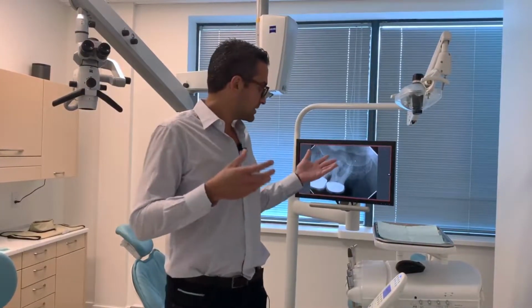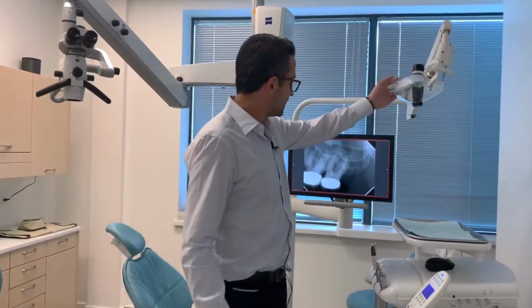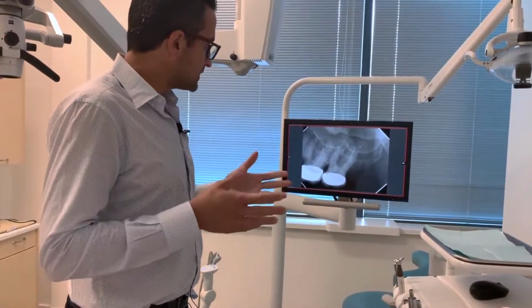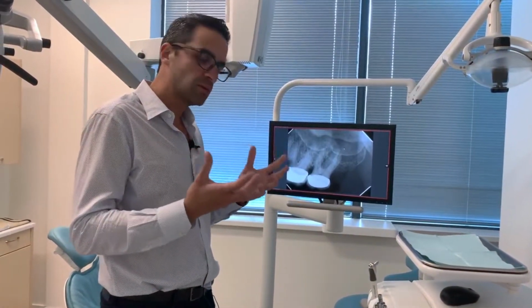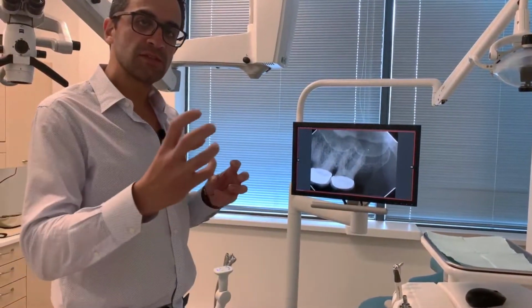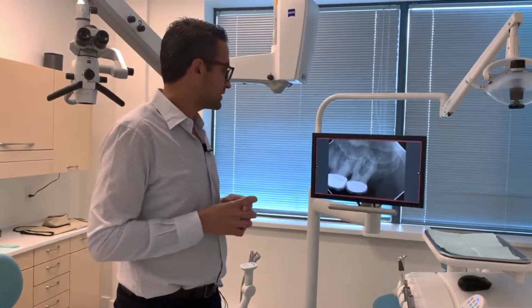And I took an x-ray, as we can see here, of the two last upper left molars. As we can see, these two teeth have two big crowns on there, and he was always pinpointing to that side but not knowing which tooth was really the problem. And I was not able to diagnose or to really exclude one tooth or the other.